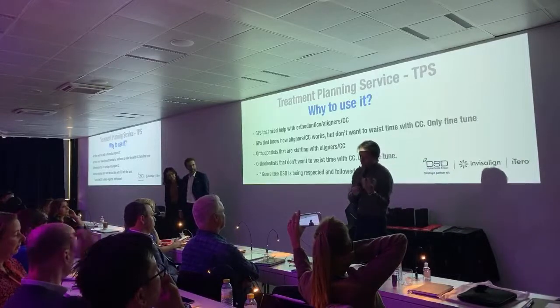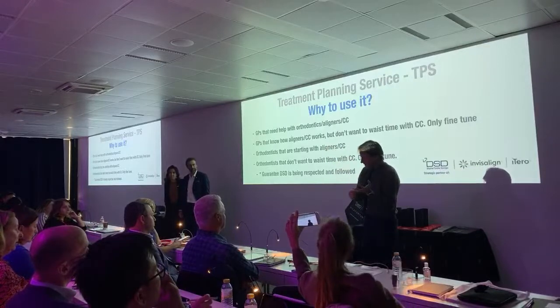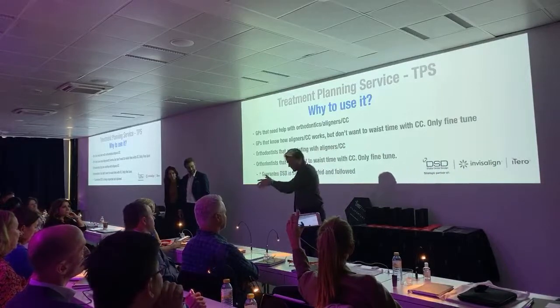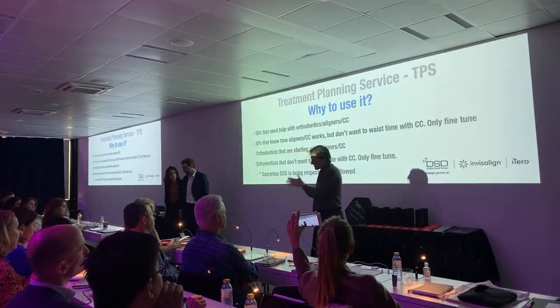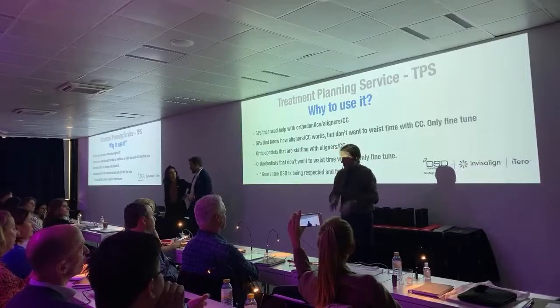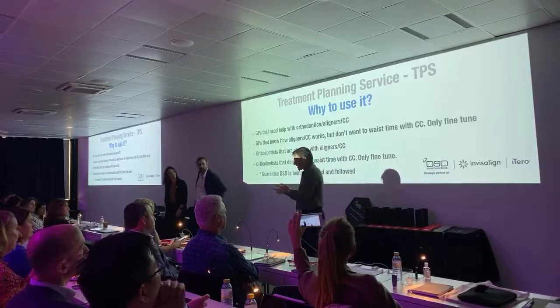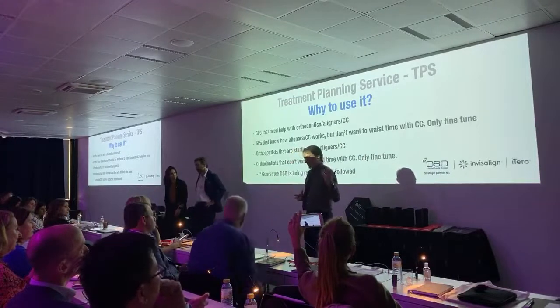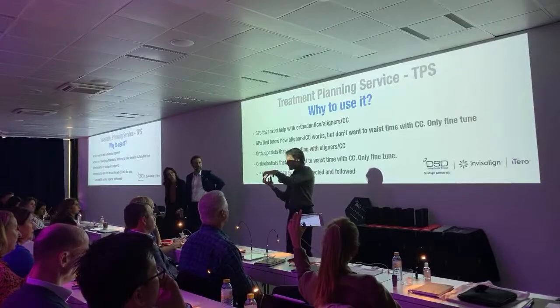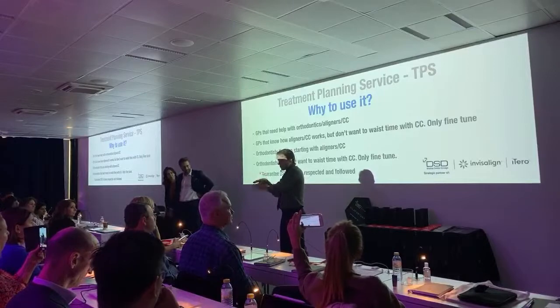Even though we know that the Nemo simulation is not identical to the ClinCheck simulation, it's good enough for you to plan and sell. If you're ordering a DSD Invisalign, it means you're ordering post-case acceptance. You want to treat. It's a treatment. It's a post-case acceptance product, meaning you don't need the Nemotec simulation because you already sold the case. You need the real ClinCheck simulation. That's why we don't redo, right? If you did an interdisciplinary order first, we're going to use that initial Nemotec simulation as a base for us to do the ClinCheck simulation as close as possible. Okay? So it's a post-case acceptance one.